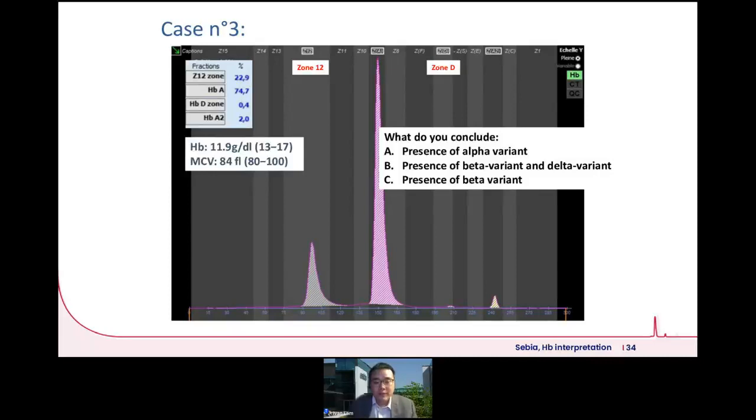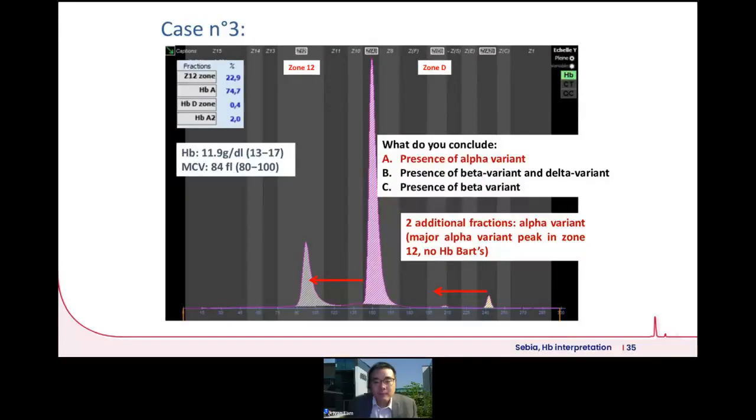So how about this case? So you see a splitting of the major hemoglobin A peak. Look carefully at hemoglobin A2. You do also see a little hemoglobin D zone, although it's in a very small proportion. So what does this remind you of? A splitting of the hemoglobin to a smaller peak, and this happens equidistant for every different hemoglobin type. Okay, so this is the presence of an alpha variant.